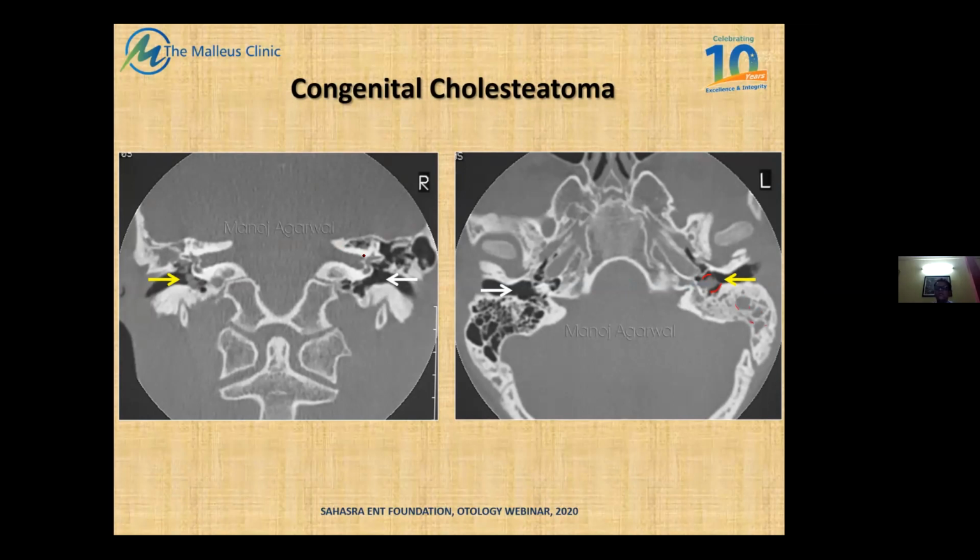Mind you, the cholesteatoma is localized here. And something that I was telling you from the earlier parts of the presentation, the trabeculations are still maintained. So probably this cholesteatoma is causing some kind of eustachian tube blockade, which has led to a fluid collection within the mastoid antrum rather than this being cholesteatoma itself. But then that again is not a given. And obviously the final confirmation of the whole fact would be only after surgery.